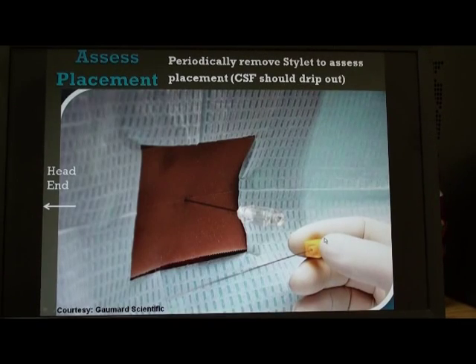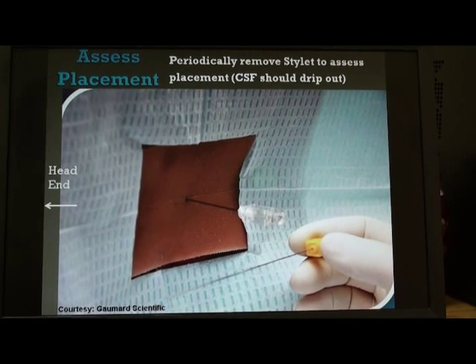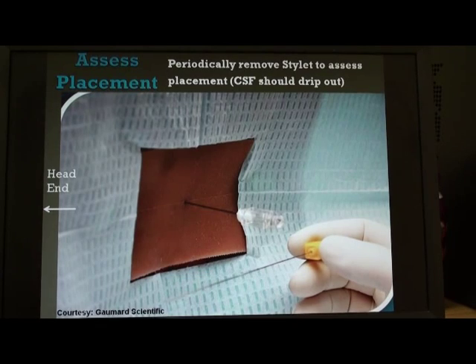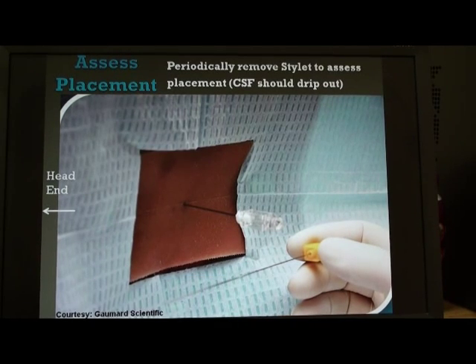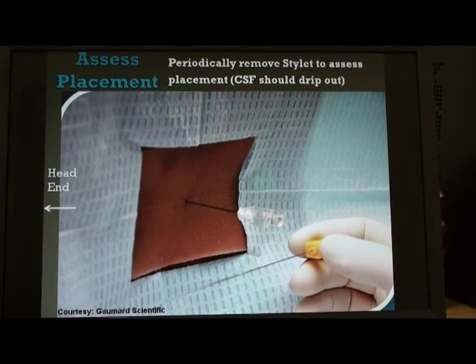The needle is gradually advanced. The layers it pierces through are: skin, subcutaneous tissue, supraspinous ligament, interspinous ligament, ligamentum flavum, extradural space of the spinal canal, and then it pierces through the dura-arachnoid membrane. Once it pierces through the dura-arachnoid membrane, we will typically feel and hear a pop sensation, which is the indication that we have entered the lumbar cistern.